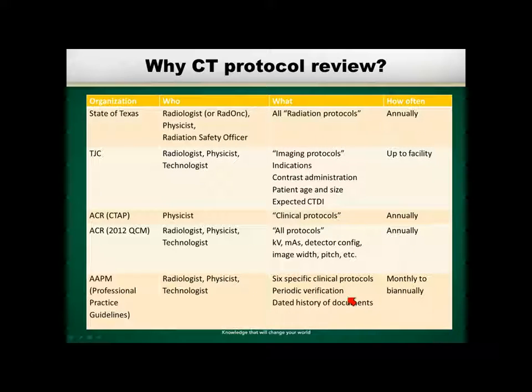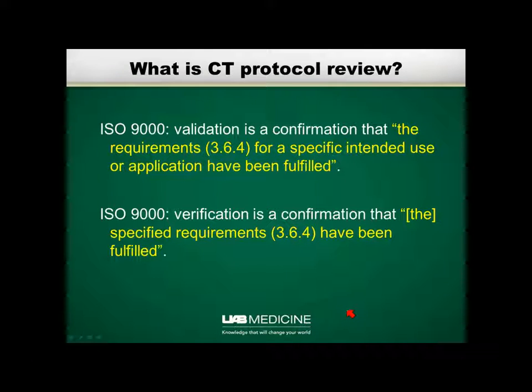Now, the title of my talk is Validation and Verification. What does that mean? Validation and verification are terms from ISO 9000, which is a set of standards for quality control procedures. Validation basically is a process to ensure that the system you are designing, whatever it is, building a car, automobile, CT protocol, meets what the intended use is.